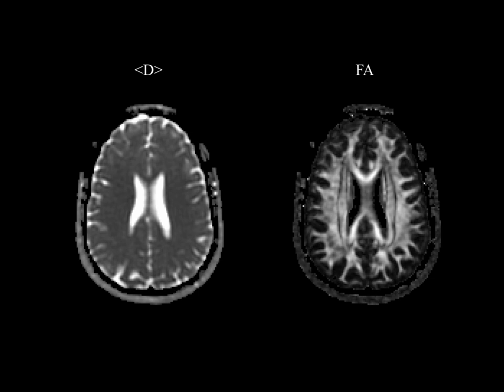So within that voxel, it looks isotropic because of the different directions that the axons are running in. So what we measure is something that's spherical, but the underlying tissue has axons running in multiple directions there. So this is also a partial volume effect, yes.